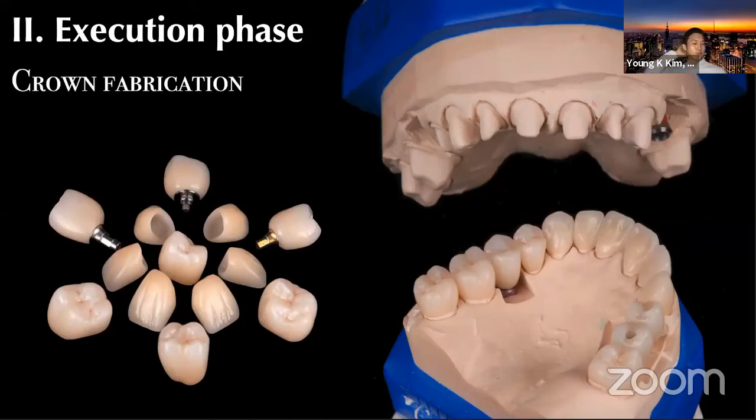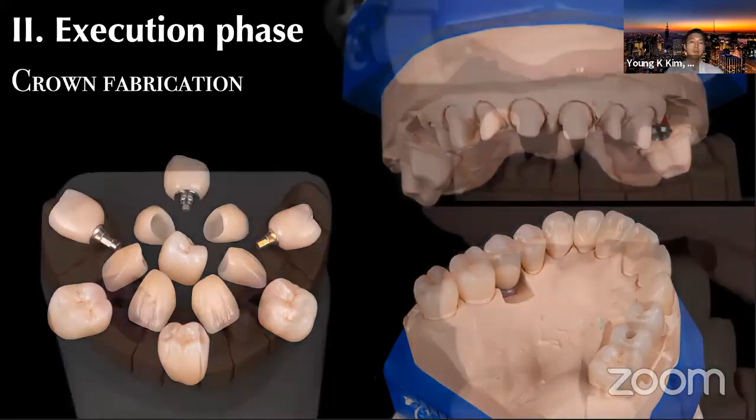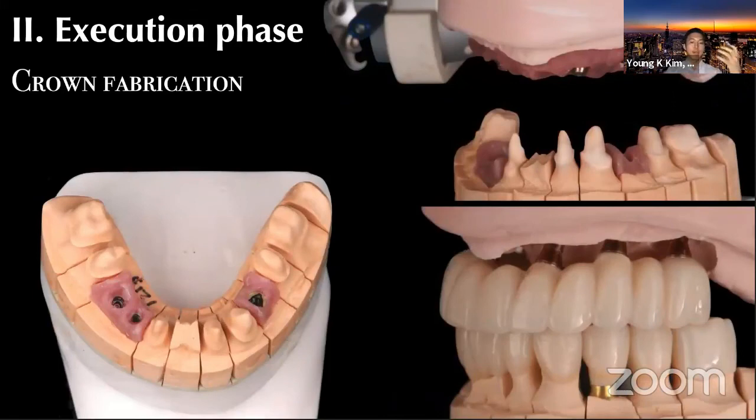And the Vita Triluxe is a milled monolithic multichromatic porcelain. So with a proper bonding protocol and the retention resistance forms, we can expect excellent quality work done with these types of processes as well. And if you send a high quality cast and mounting, we'll inevitably work with a master technician who will get back to us with masterpieces.